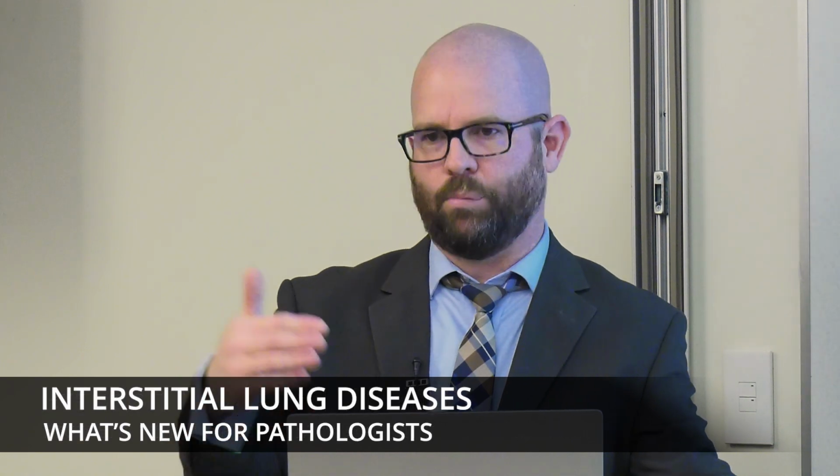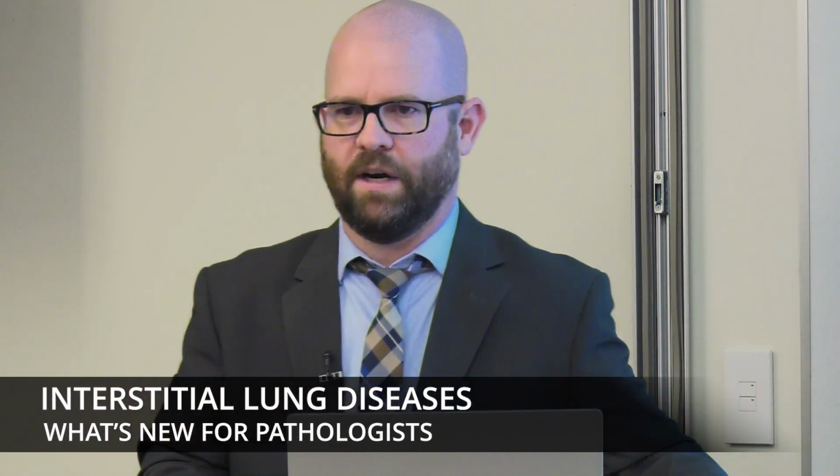So on the bottom line, I would call that chronic fibrosing interstitial pneumonia, with features most suggestive of underlying systemic connective tissue disease. And in a comment, I might say, there's a fibrotic process. It's quite heterogeneous. It has features that are most consistent with a UIP-like pattern. However, there's also prominent lymphoid hyperplasia and these other features that suggest an alternative diagnosis to IPF. And in particular, connective tissue disease would be the leading consideration. And I dance around it that way.